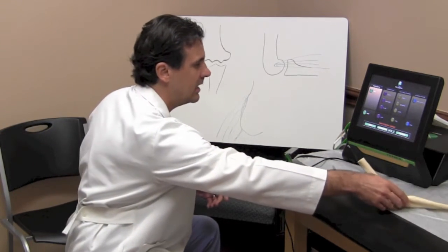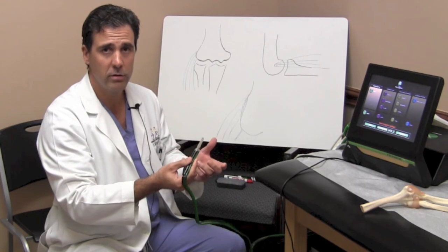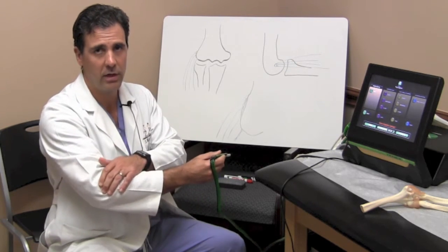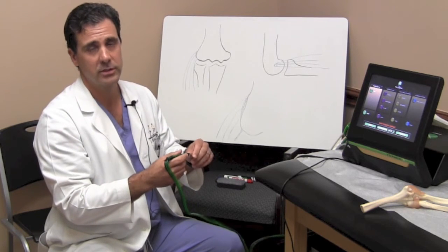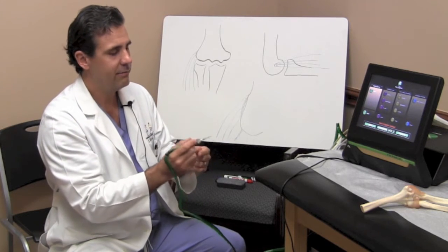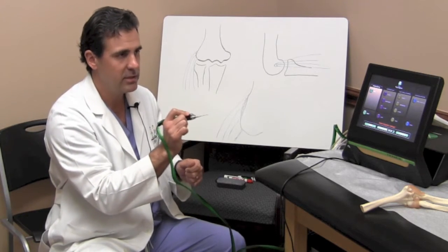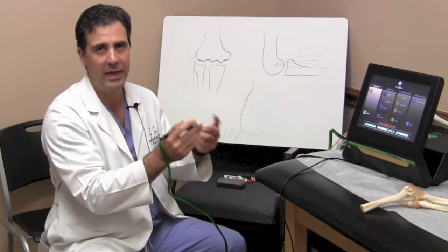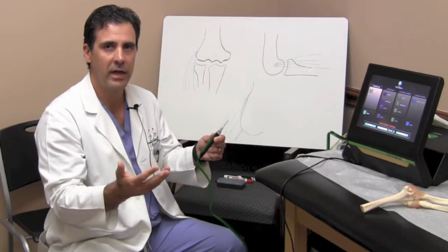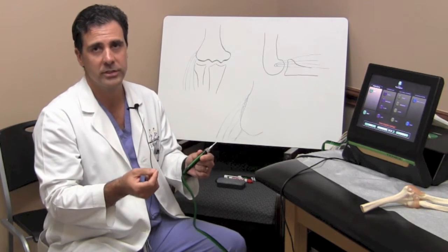The idea behind Tenex is to use a smaller incision than the typical incision for an elbow scope, which is one of the options we do for tennis elbow, and definitely smaller than an open debridement of the lateral elbow. This is what we call a micro incision, where we make a small poke hole into the lateral elbow and identify the degenerative tendon and the tendinosis with this little pinpoint needle, and specifically debride that area of tendinosis, removing the pain generating tissue. The benefit is that you're preserving all the healthy tissue around that area and specifically going after the diseased tissue, which we do by identifying it with ultrasound guidance.